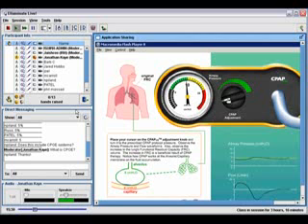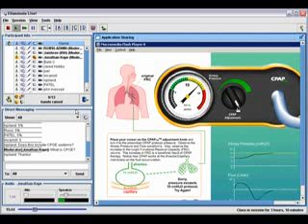It's also showing them the impact if they go too far, beyond what their protocol says, where they'd be having an impact on the pulmonary circulation, compressing a capillary right here and affecting the cardiovascular system. So it's a way that they can see what they would see on the actual device, as well as the physiological impact, without actually having the device right there in front of them.